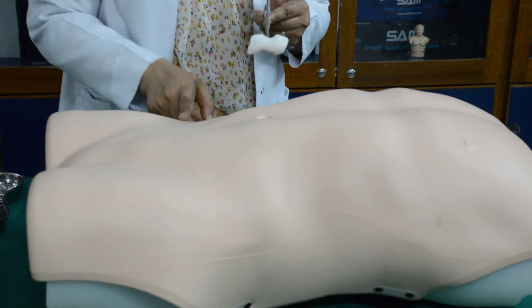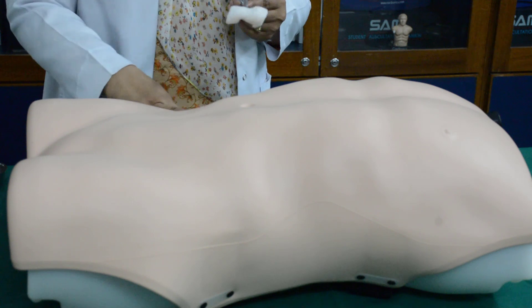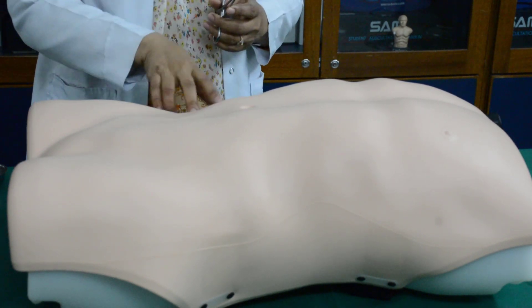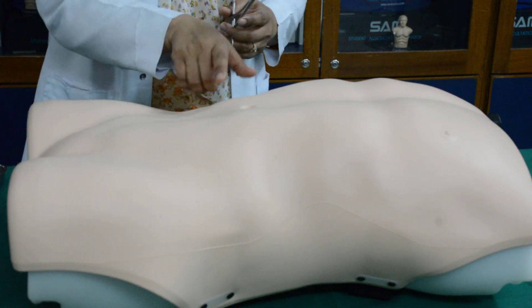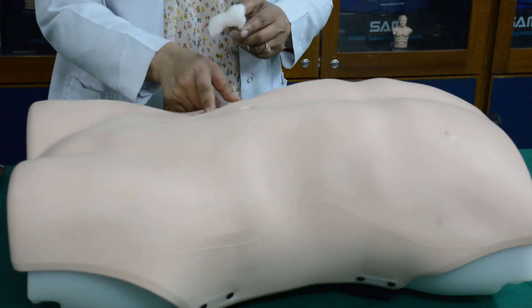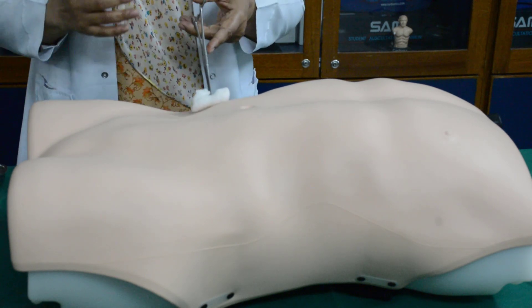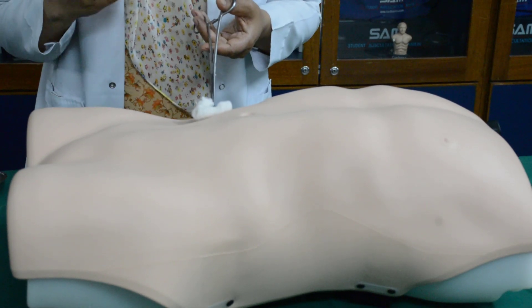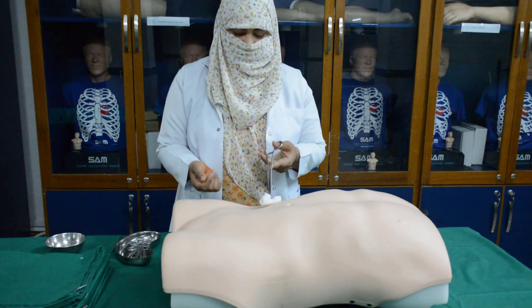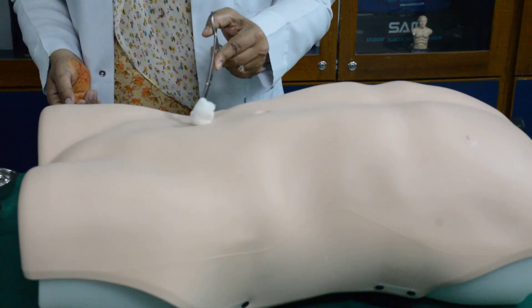This is our right lower quadrant. Here you will mark the umbilicus and the anterior superior iliac spine. You will imaginarily draw the spinoumbilical line, and at the junction of the medial two-thirds and lateral one-third is the incision site for appendectomy. You will start cleaning from this point, which is the reason you must know the procedure to be performed, so you can clean the patient accordingly.